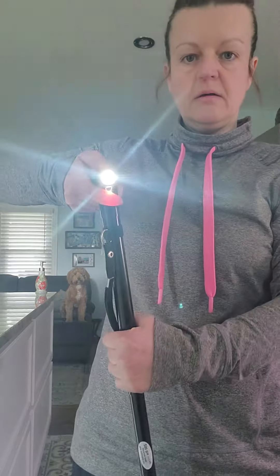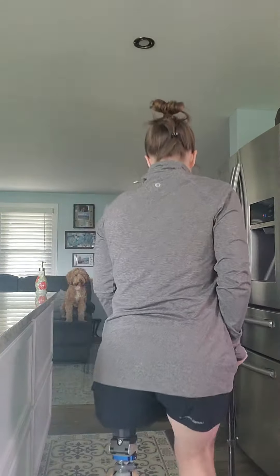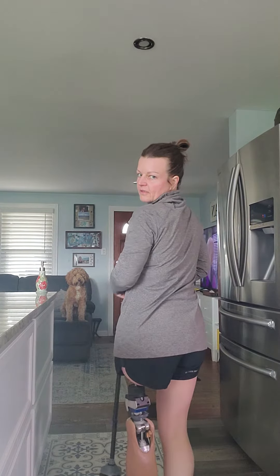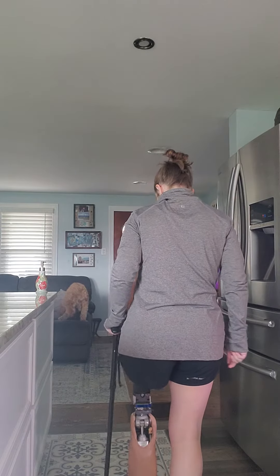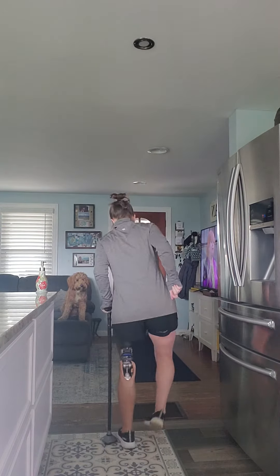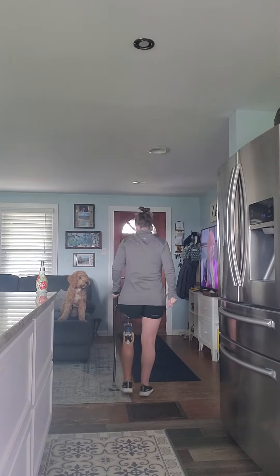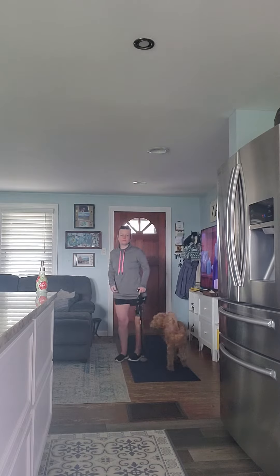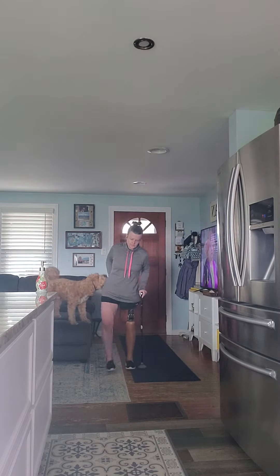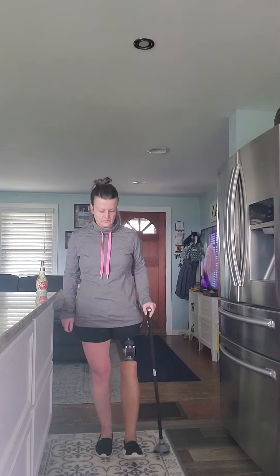Oh my god, my cane falls down all the time — I cannot wait to get rid of this thing. Walking with the right side, this is not pretty but I'm trying. Got my physical therapy buddy here, trying to get all my muscles working.